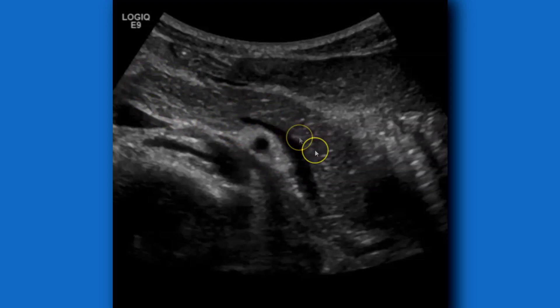Here's the pancreas: the uncinate process right here, head, body, and then the tail. The tail is sometimes the hardest part to get, and this may not be the entire tail — keep that in mind.